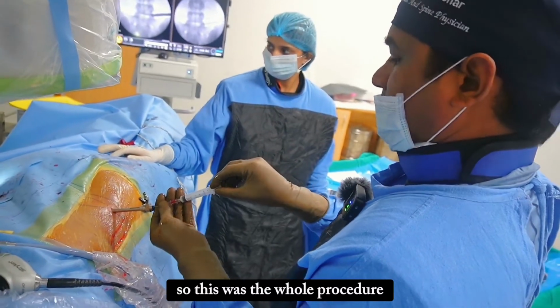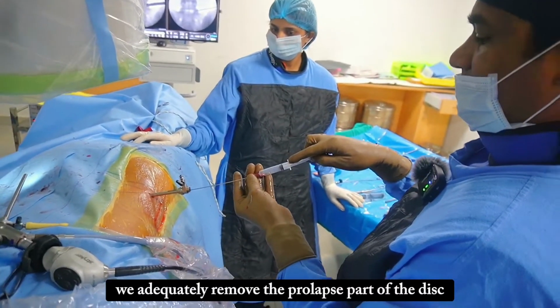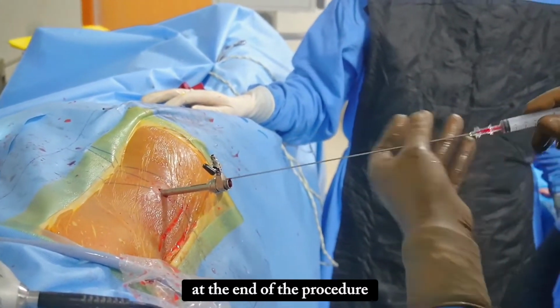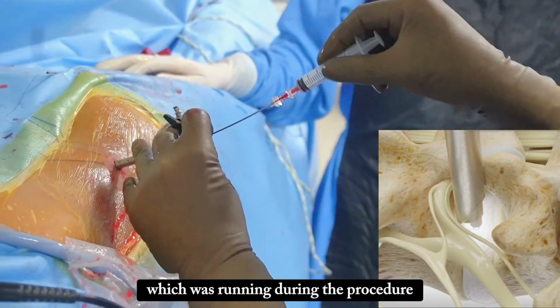So this was the whole procedure. We adequately removed the prolapsed part of the disc. At the end of the procedure, we will aspirate the fluid which was running during the procedure.